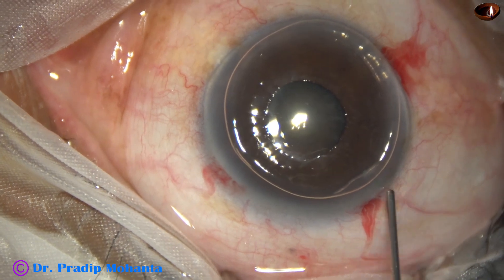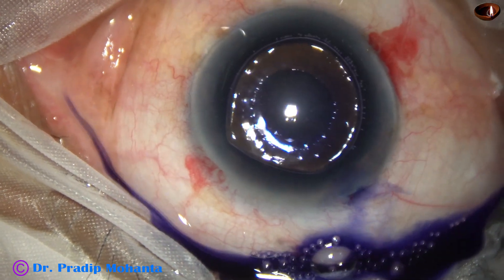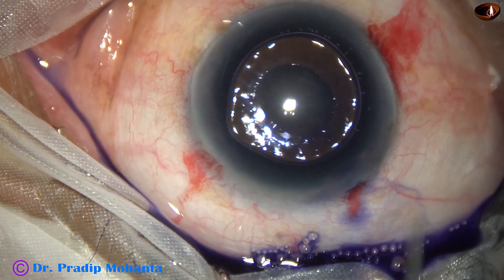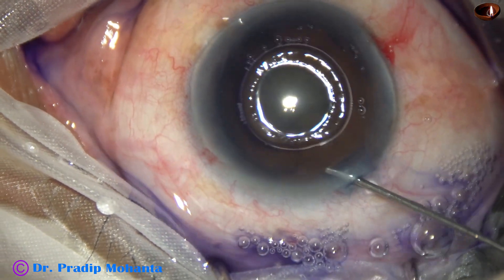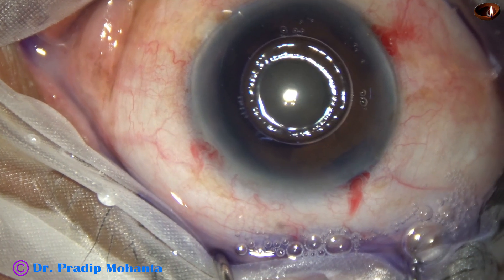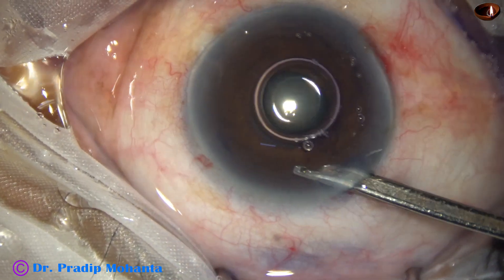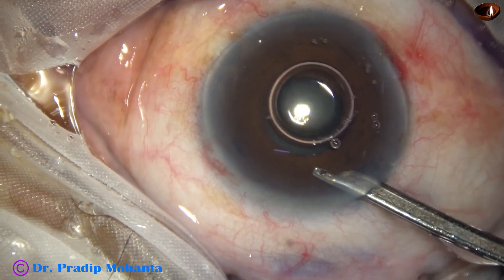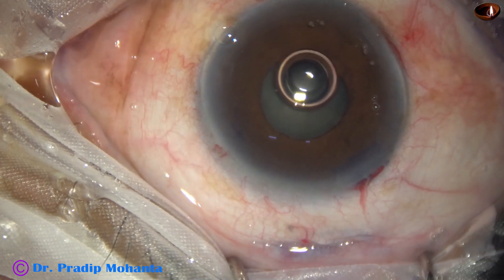Underneath this air bubble, trypan blue dye is applied over the anterior capsule. Now this is adrenaline. Let us see if the pupil dilates with adrenaline. The dye is washed out and we see that adrenaline had zero effect, no effect at all in this case.